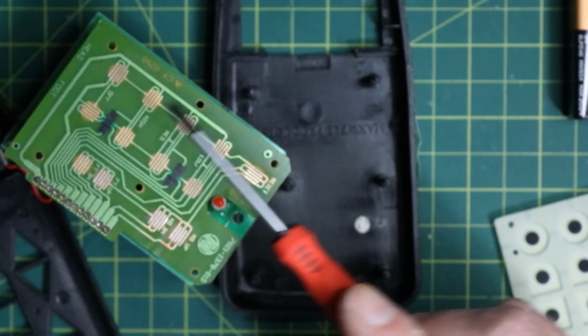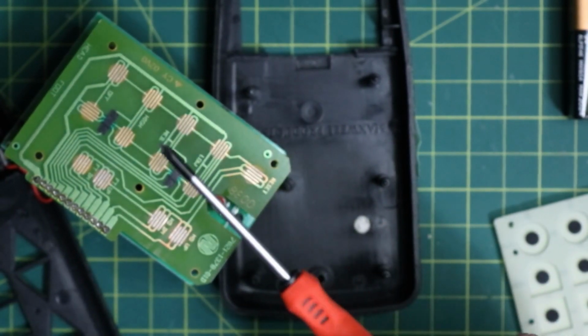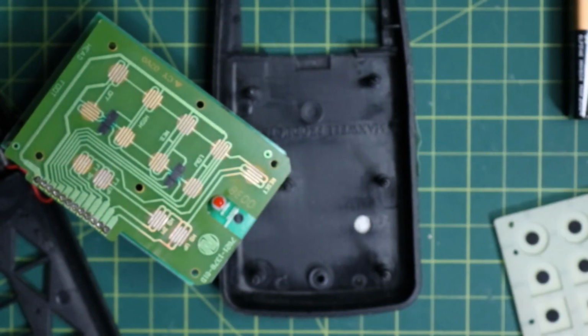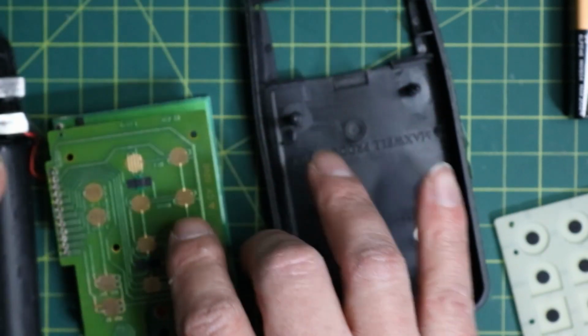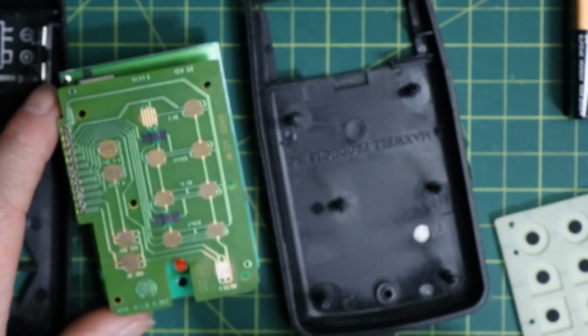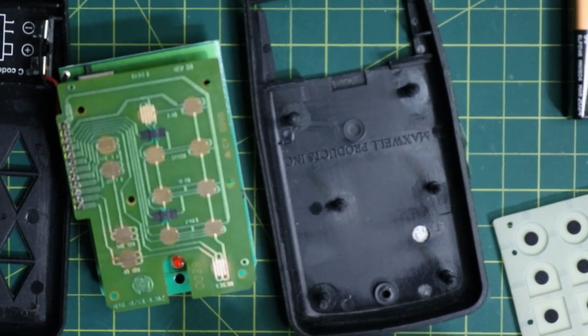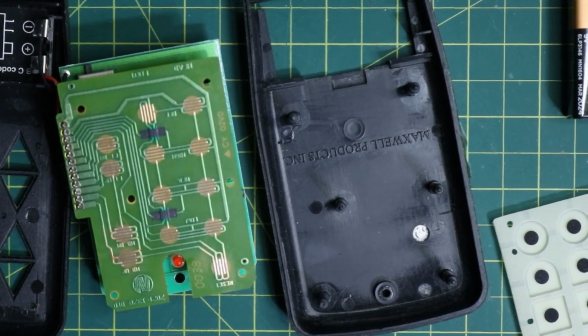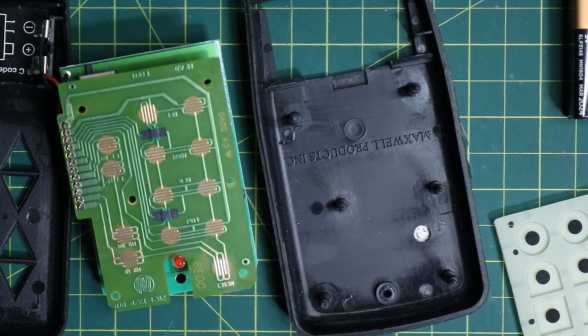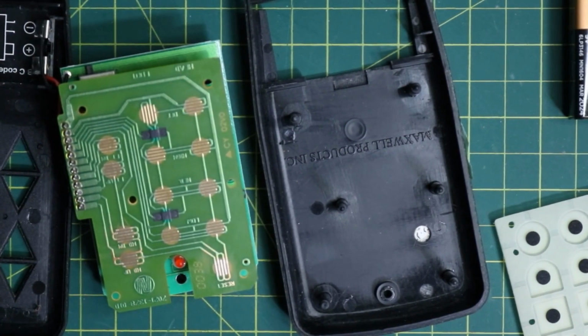So I did mention about this board here. If I find that the inlay is still good, I will maybe see if I can do up a board for this to replace it. I'm not too sure how I'll do it. Maybe I'll use KiCad and see if I can't use that to design the board up.